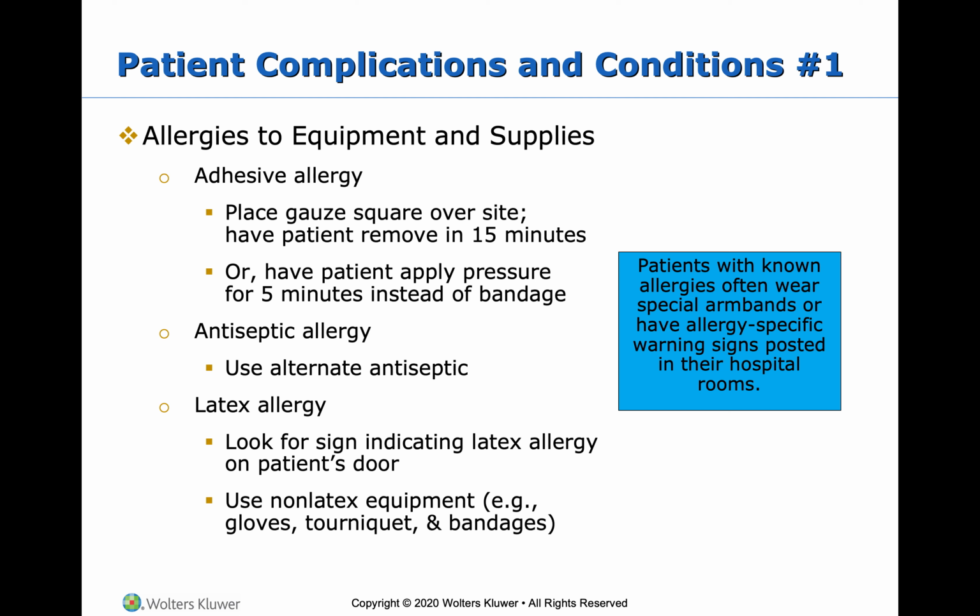A lot of patients do have an adhesive allergy. We use paper tape. That's the only adhesive material that we use as phlebotomists. I always ask if I'm going to use paper tape. I always say, is paper tape okay? If it's not, Coban. I prefer Coban over paper tape, but there are some situations where paper tape is more sufficient.